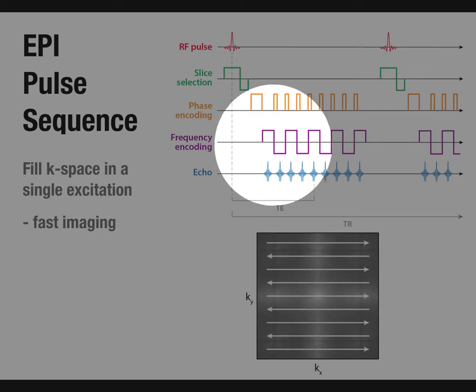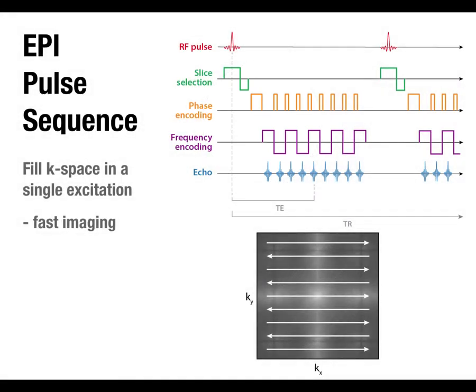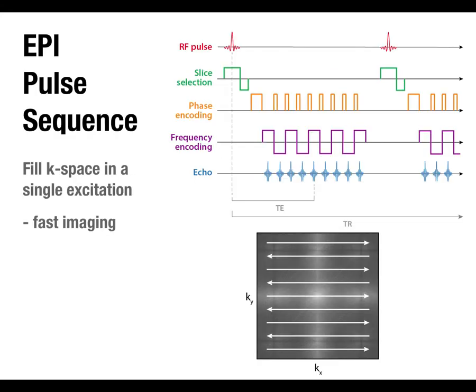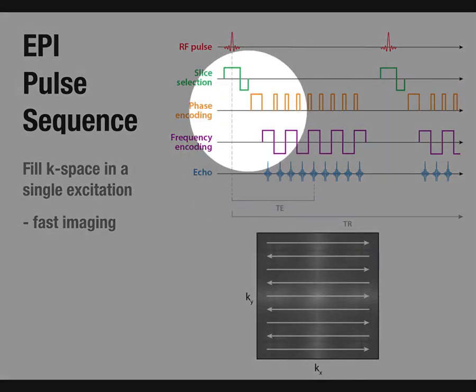And the way they do that is essentially not any different from the structural sequences, right? You still have to create a magnetic field gradient and then read that signal out, create a magnetic field gradient, read it out. But where the conventional sequence does that slowly over time, here we do the phase encoding step, turn on frequency encoding, then we do another phase encoding step.